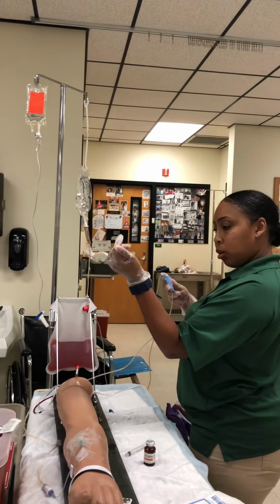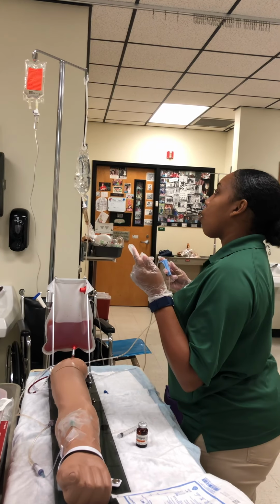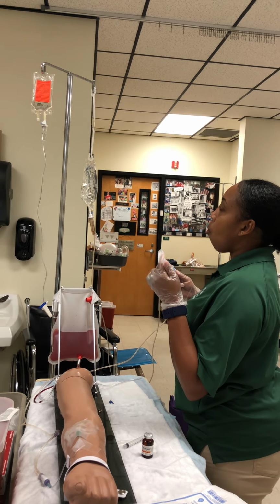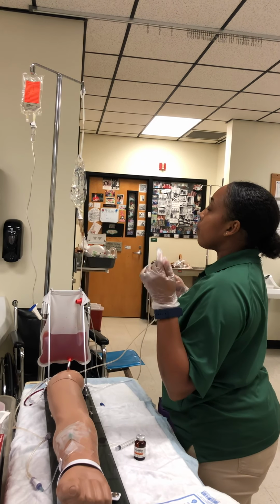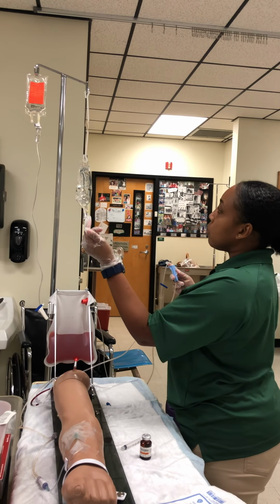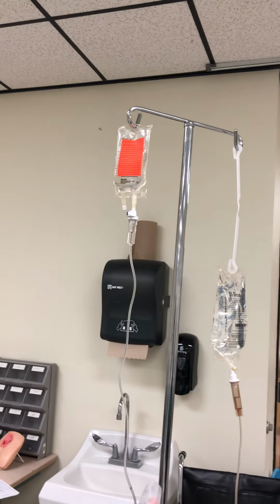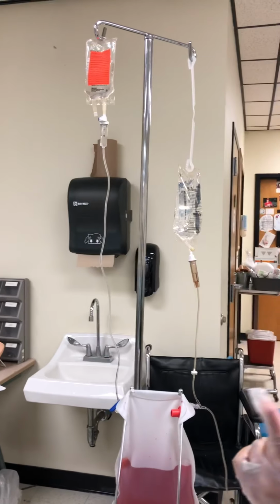Too slow. A little bit too fast. Let me count one more time.